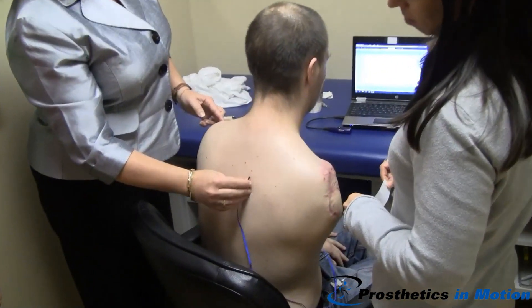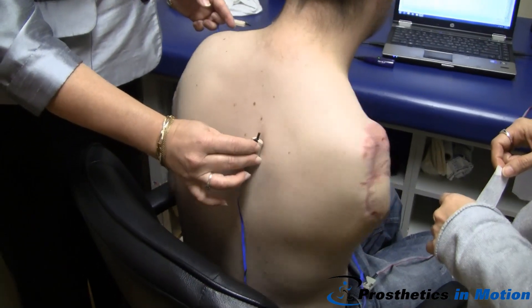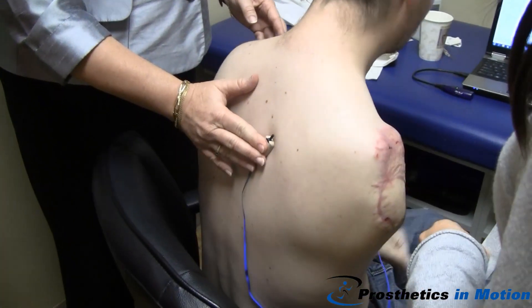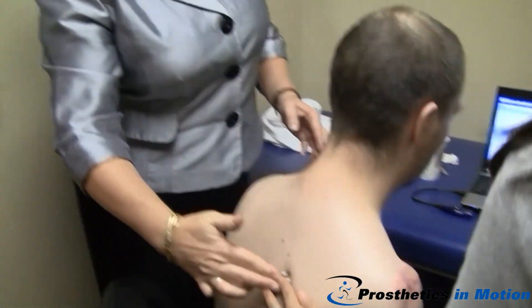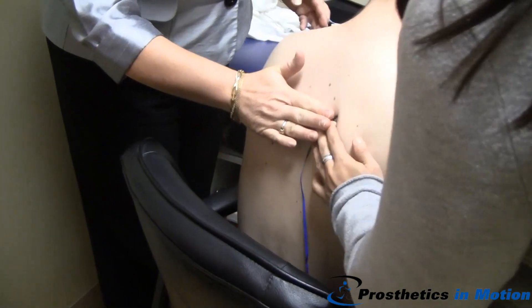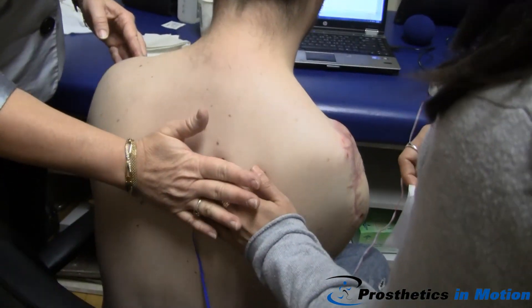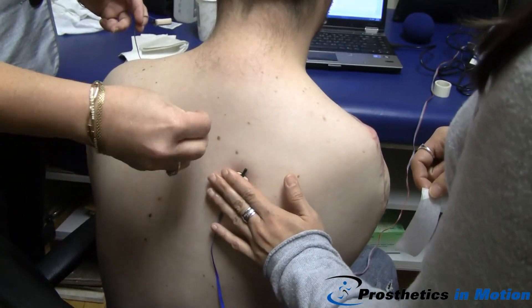So how do we interpret that? We'll check it out. Bring straight back and relax. Now look at the screen for us. You want to try to put even pressure on the electrode when you're testing — it's even okay to put your entire hand on her like you're the socket, because it's going to interpret like a whole action potential of that muscle.